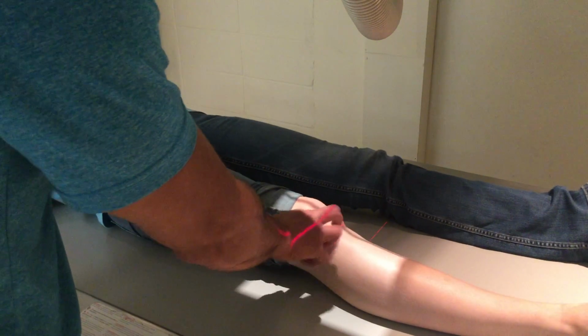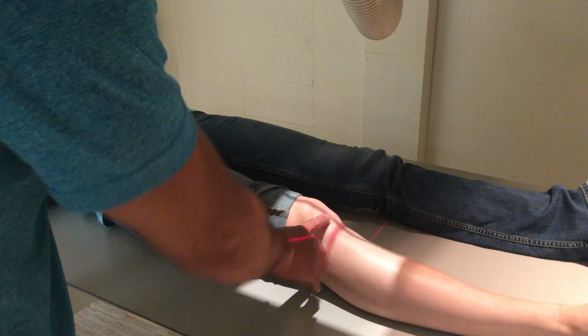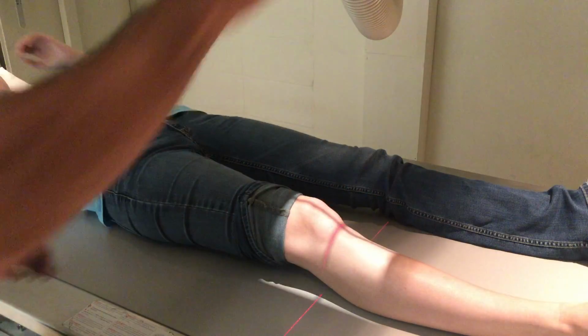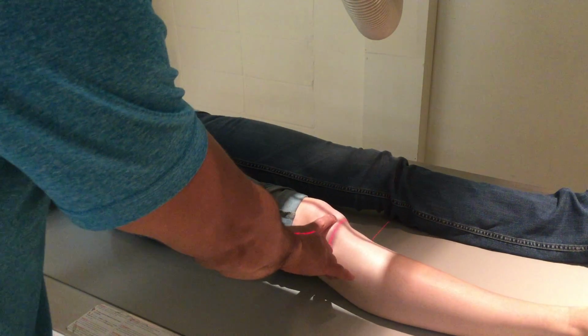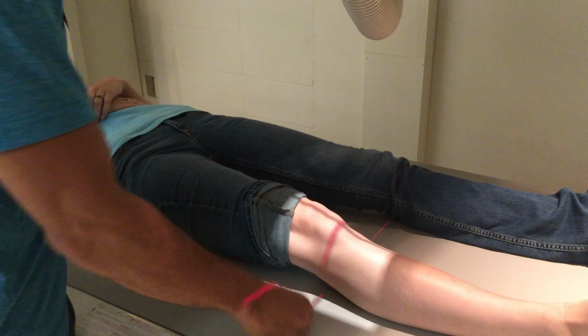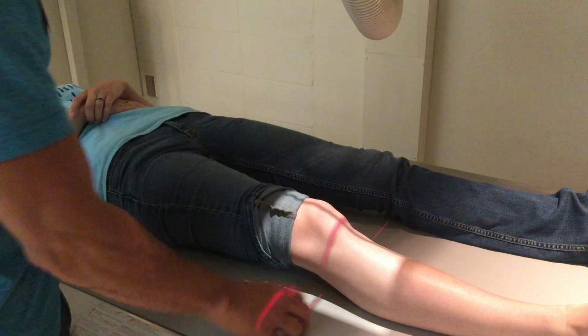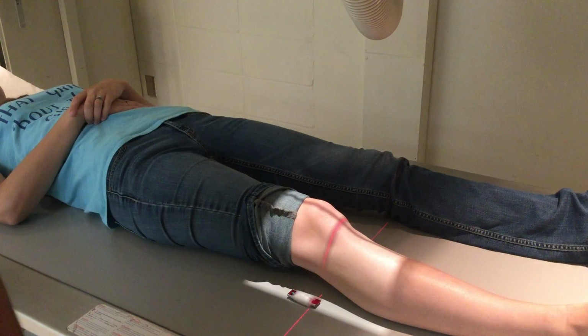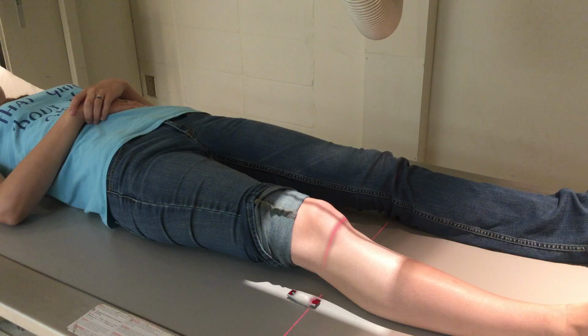You guys are gonna run into that. So you want to be, again, a half an inch below the patellar apex. I don't collimate top to bottom really on my knee, just left to right. That angle, we're all centered, and AP knee, it's perfect.